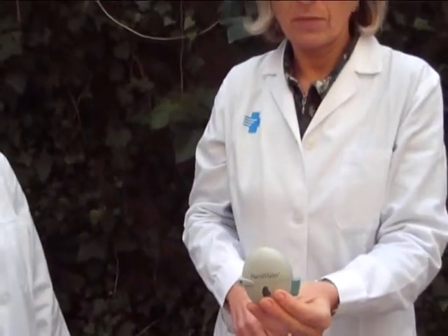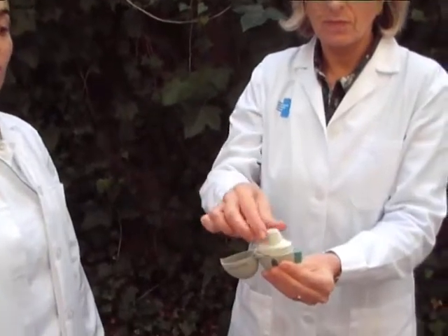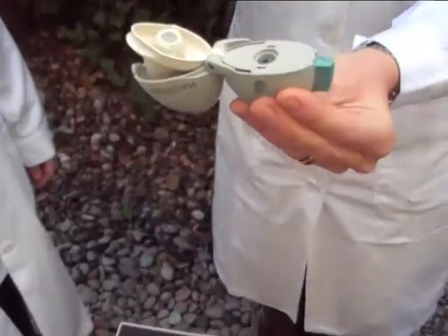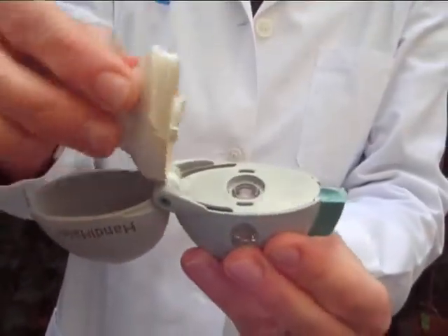We will now explain how the hand inhaler works. Firstly, you must open the cap by pulling it upwards. Then lift up the mouthpiece. Put the capsule in the chamber. Close the mouthpiece firmly.